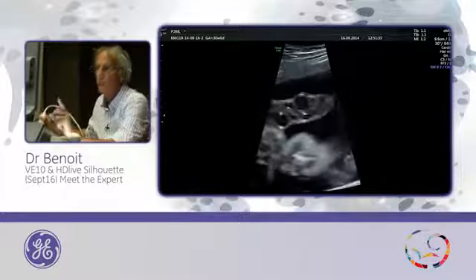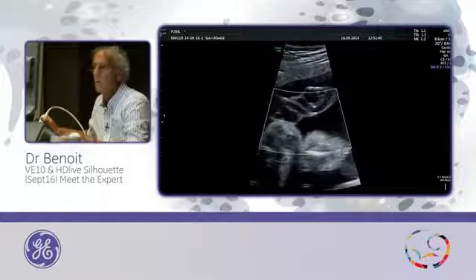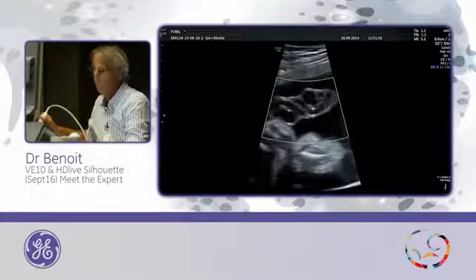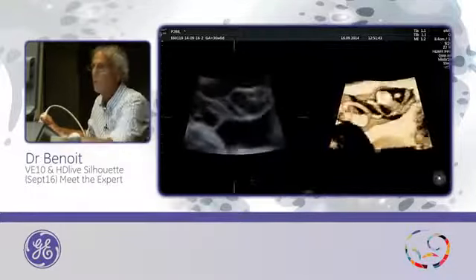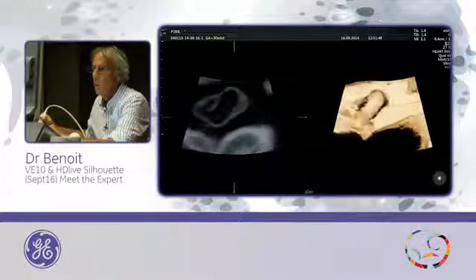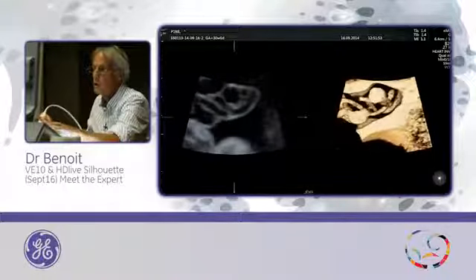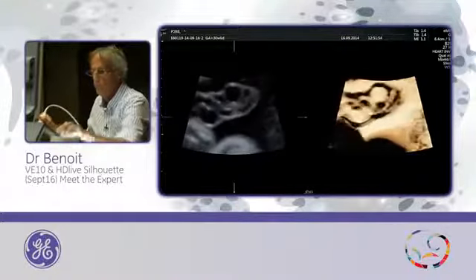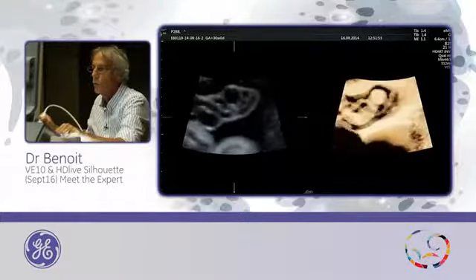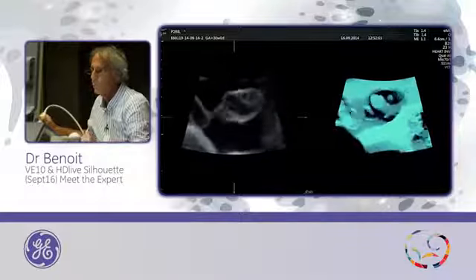So this is a nice tool especially for the heart, but also for all the parts with liquid. Look at this umbilical cord. I will do it on the umbilical cord. Okay, I start. And this is a view of the cord with one vein and two arteries. And we can change transparency. I increase the thickness. And I can switch to the blue.